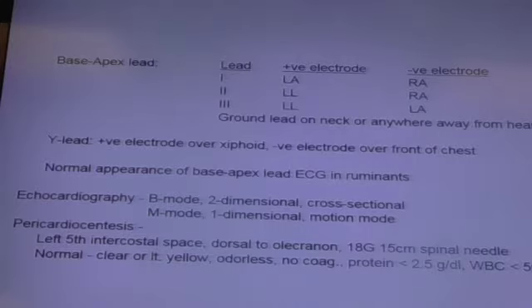The other thing we drill into is base apex lead versus Y lead. I try not to memorize stuff too much, so I'm not going to ask you to remember that the positive electrode on the lead is the left leg. It doesn't make sense to me to try to memorize this.